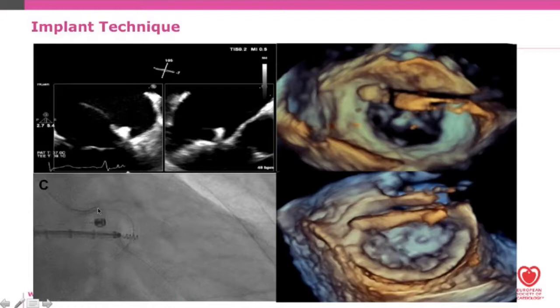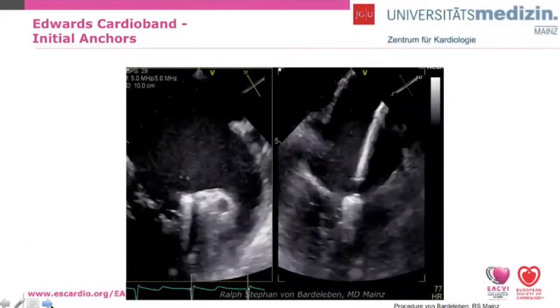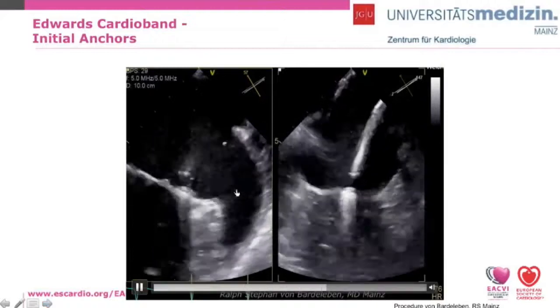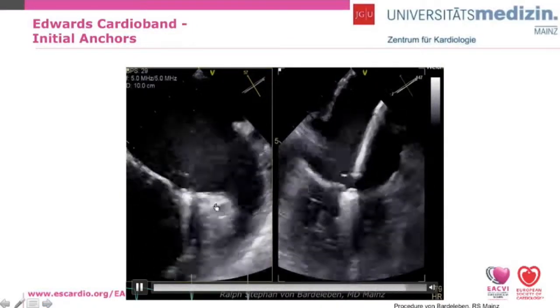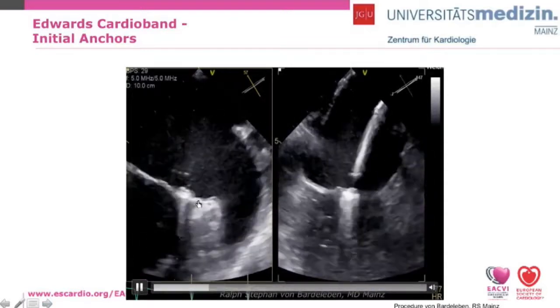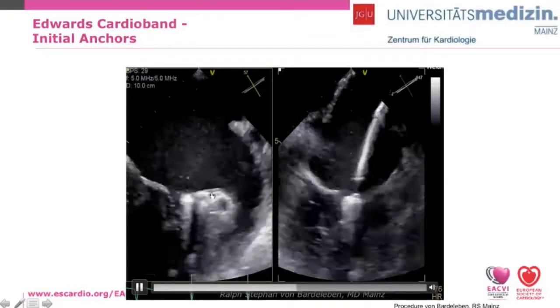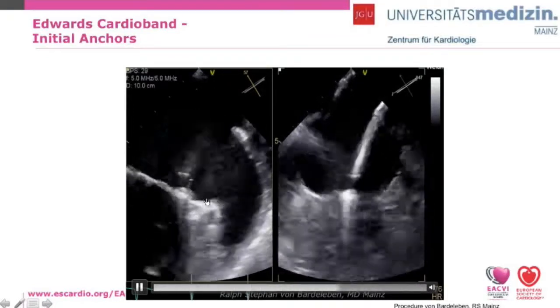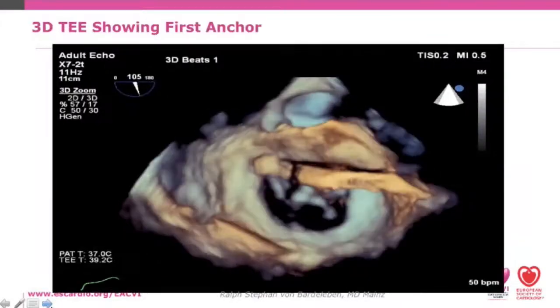we screw in next to the left circumflex coronary artery, we screw in screws along the mitral annulus. You see these in X-plane here. We're near the left atrium, left atrial appendage. Here's the circumflex artery and the beginning of the coronary sinus, and here's the hinge point, as you see. We're on the hinge point on the leaflet with the catheter. We have to move in our landing zone between the vessel, the coronary vessel, and the leaflet.